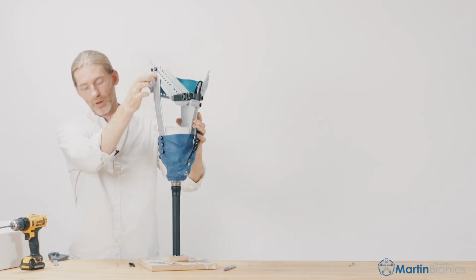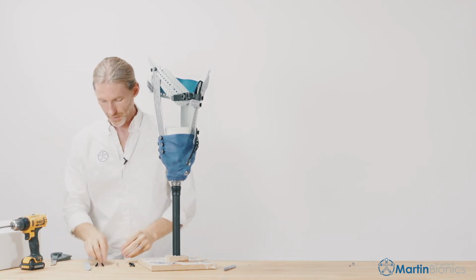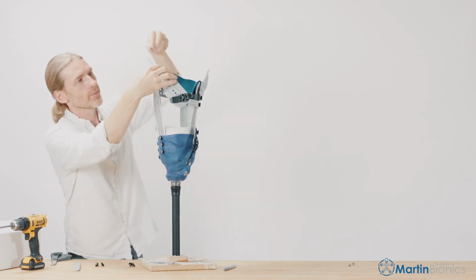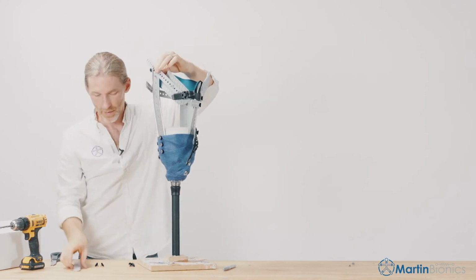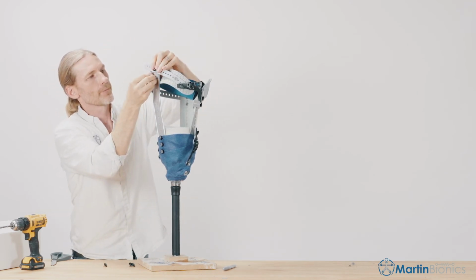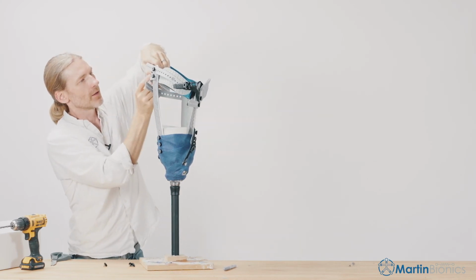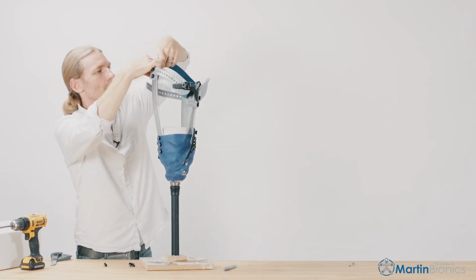And last, I'm going to do one more cross connector proximally across the 2 lateral struts. I'll do this one in the 2nd hole down. And this one will just keep these 2 struts from wanting to yawn apart under weight bearing. Should be good right there.